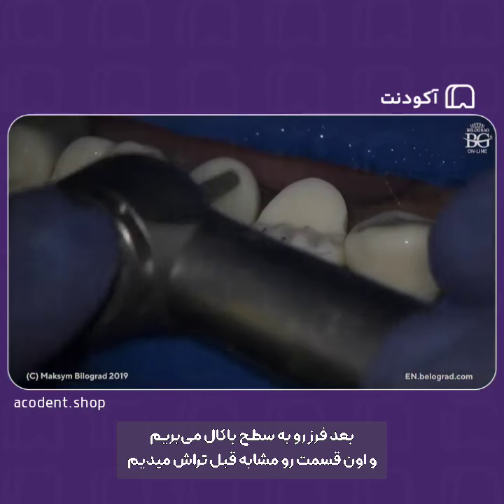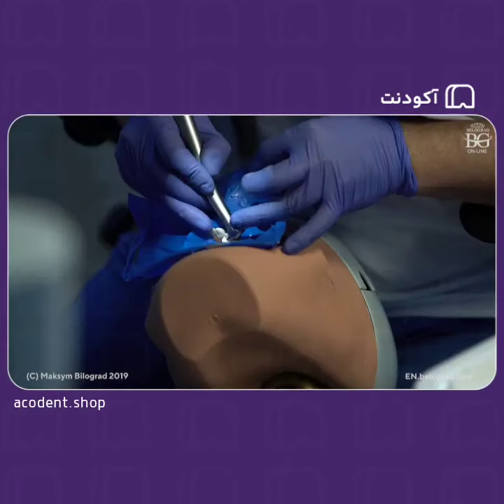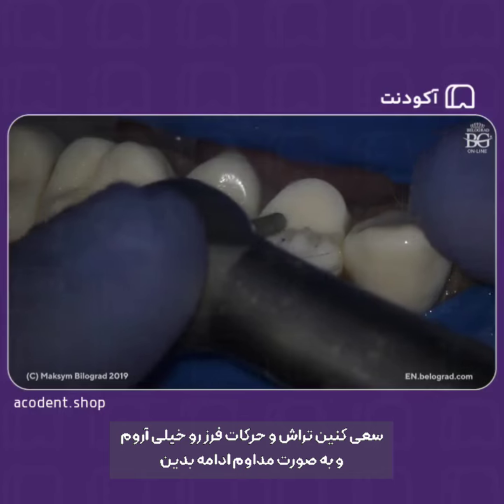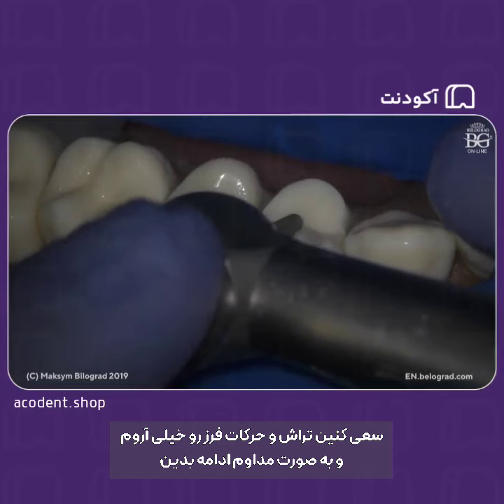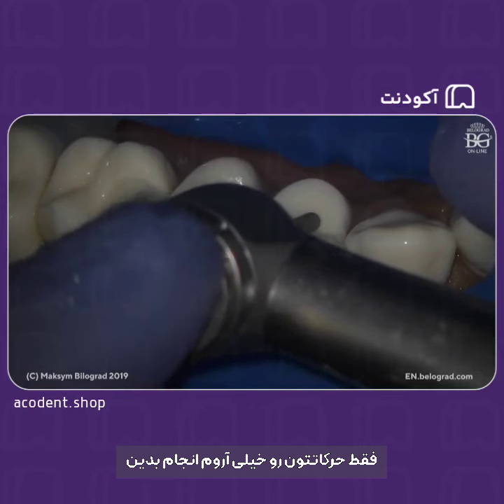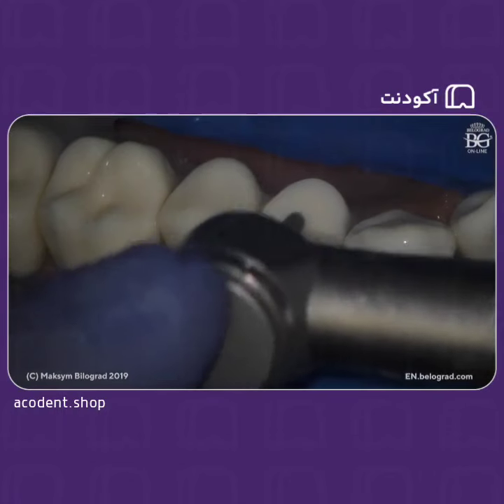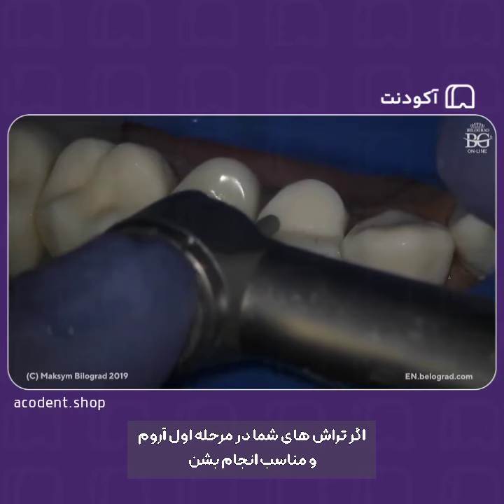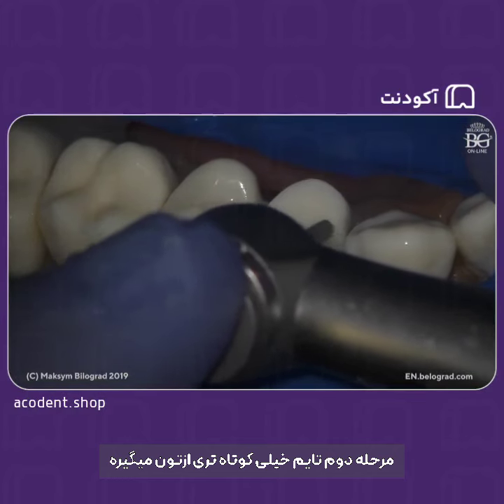Okay, then we will turn our burr towards the buccal surface and do the same here. Try to make your preparations and your movements more smooth and continuous. Don't make these rough preparations, just make your movements smoother. So you will spend less time during the second stage of preparation if your preps at this step are smooth.